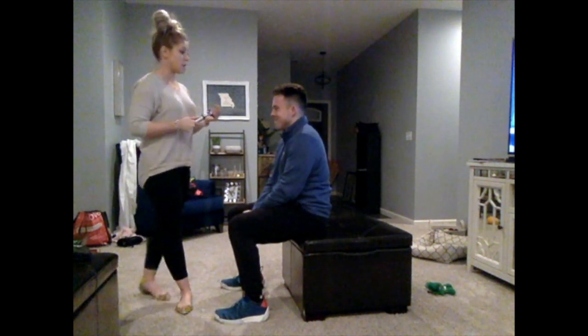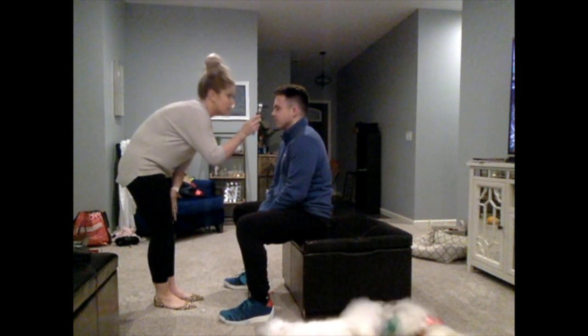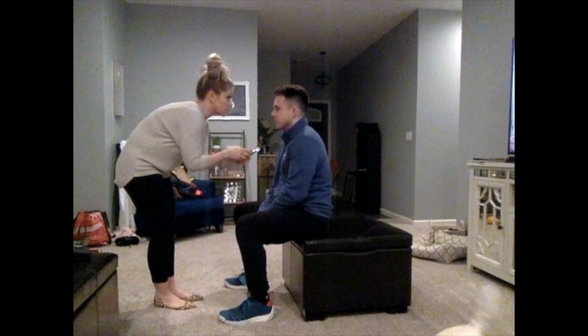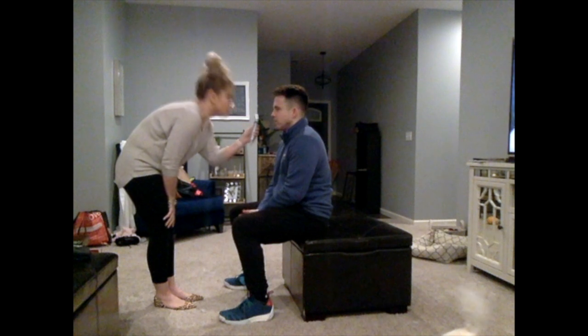I'm going to be checking the direct and consensual light reaction. So I will be pointing the light into your eye twice on each side. As I do that, I'm going to start with the left eye. I'm shining the light into the left eye, looking at the left pupil to constrict. Now I'm doing it again on the left side, but looking at the right pupil this time. They both constrict. And now I'm going to move to the right eye, pointing the light in, looking at that pupil, it constricts, and now doing it again and looking at the left pupil this time, and it constricts.